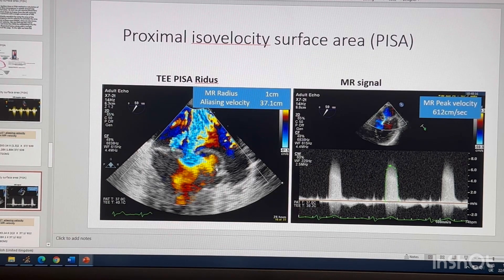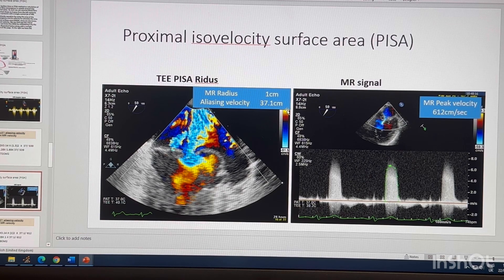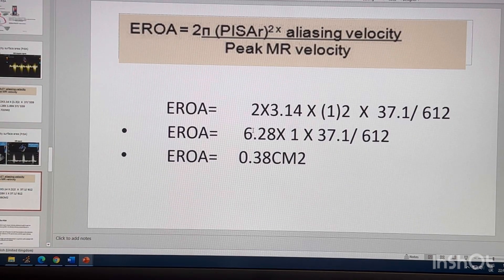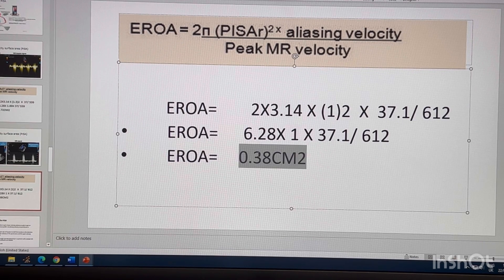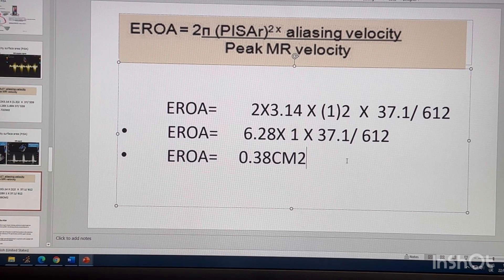Here is another example from a TOE patient. The baseline was taken upward, so you get a PISA radius of 1.0 cm, aliasing velocity of 37.1 cm/s upward, and an MR peak velocity of 6.2 m/s. Applying the formula gives an ERO of 0.38 cm², which is almost severe.